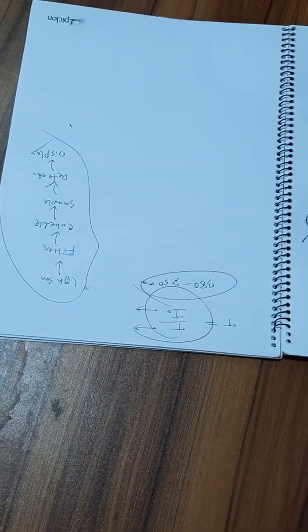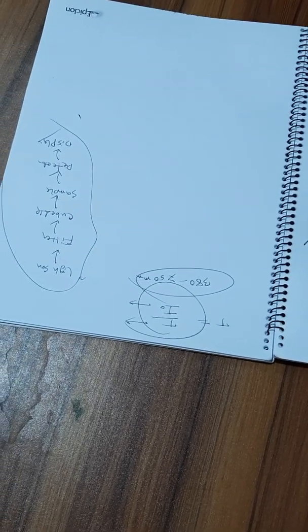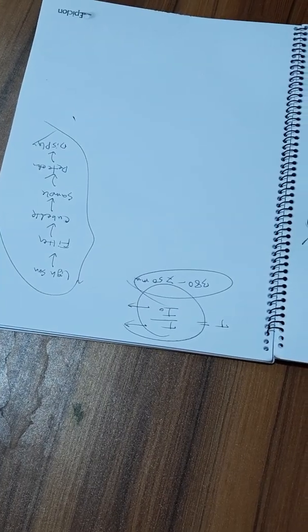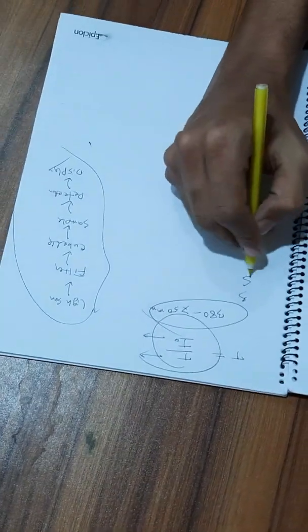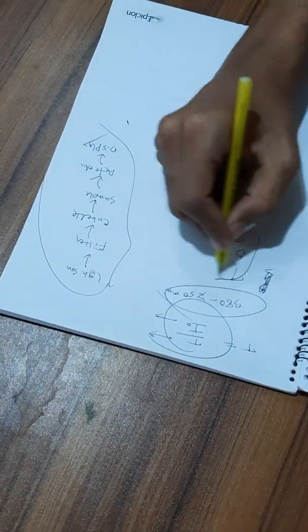We measure colorimetrically things like ALT, AST, serum bilirubin, serum cholesterol, etc., where three test tubes are used: one is test or sample, one is blank, and one is standard.